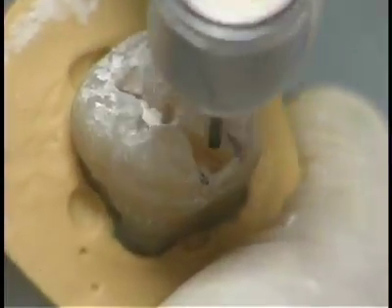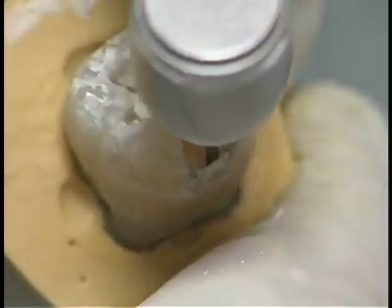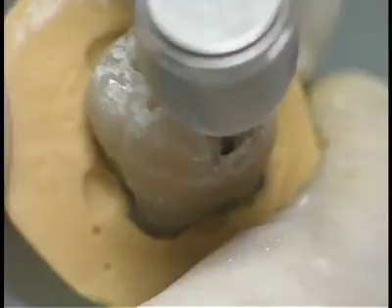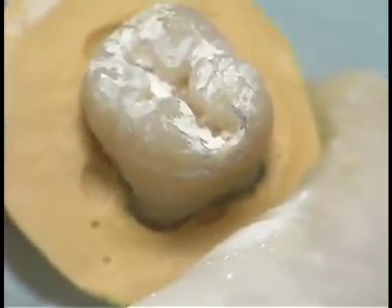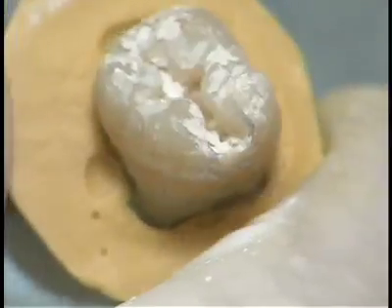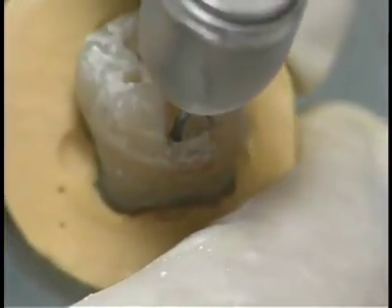After the occlusal segment has been developed, the following are seen: 1. Defined line and point angles. 2. Buccal and lingual walls parallel to each other and 90 degrees to the occlusal plane. 3. The mesial or distal wall is divergent pulpo-occlusally in the case of a mesio-occlusal or disto-occlusal cavity preparation. 4. All defects and carious lesions are removed and walls are placed in sound dento-enamel junction. 5. All unsupported enamel rods are removed and all walls are finished.